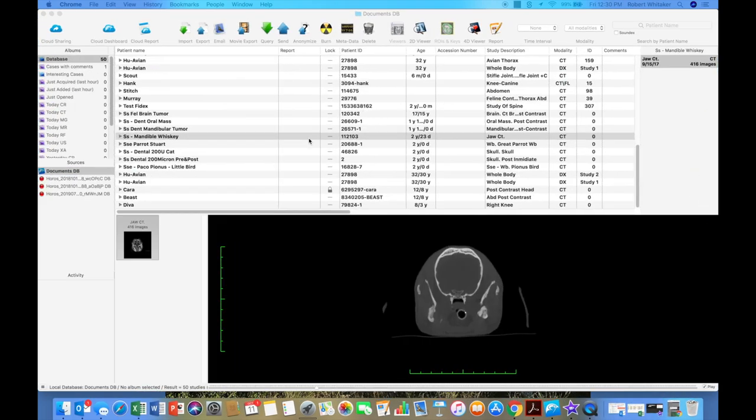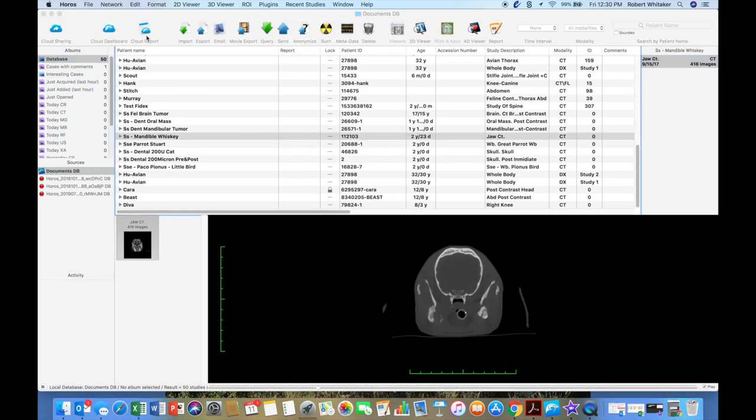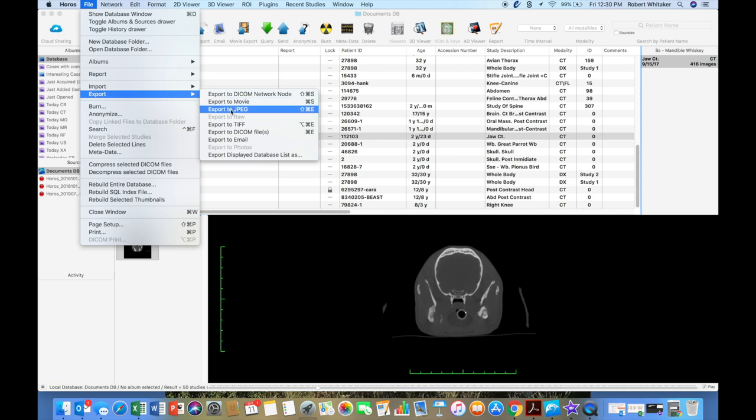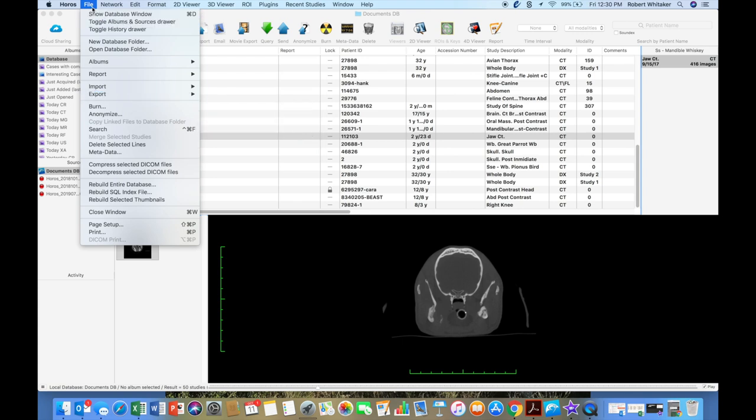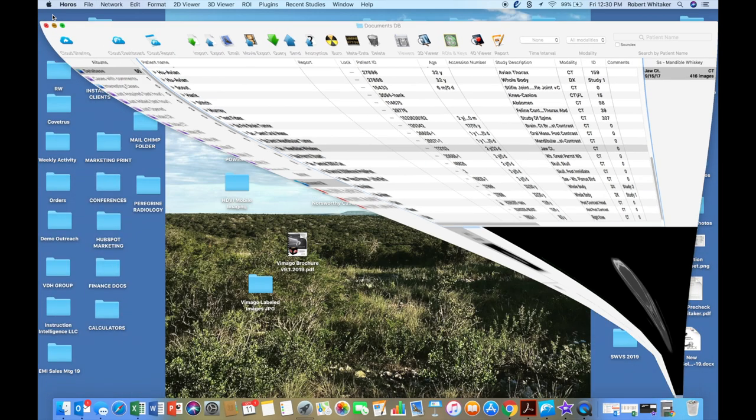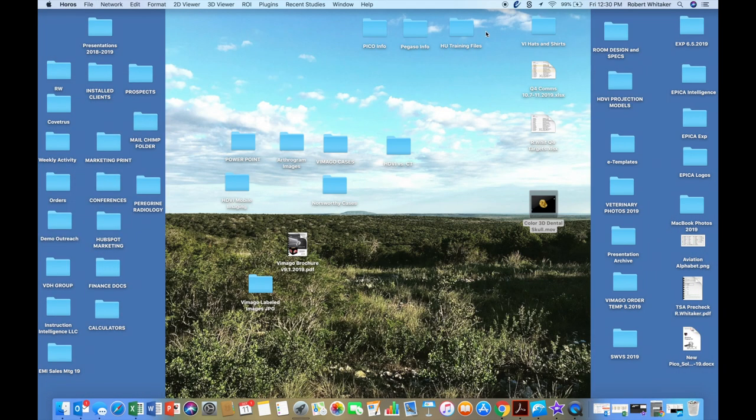If you have any other questions about exporting, you can export a JPEG image of what's on your screen as well, or you can export a DICOM image, what's on your screen. So the more you play with Horos, the easier it's going to be to use. Have a great day.